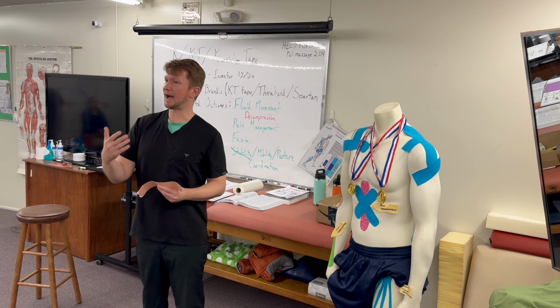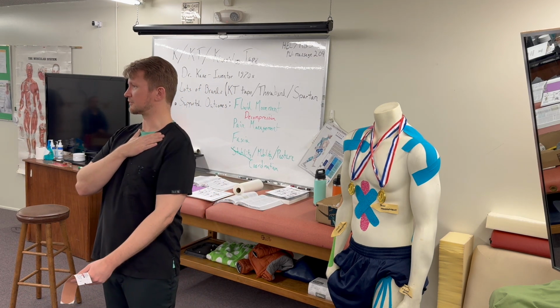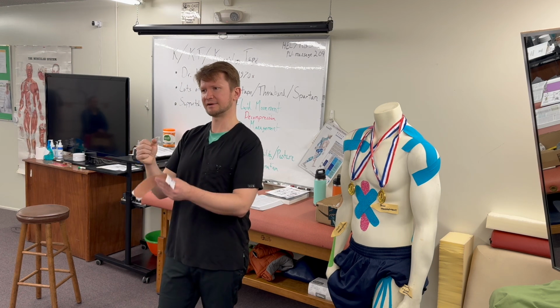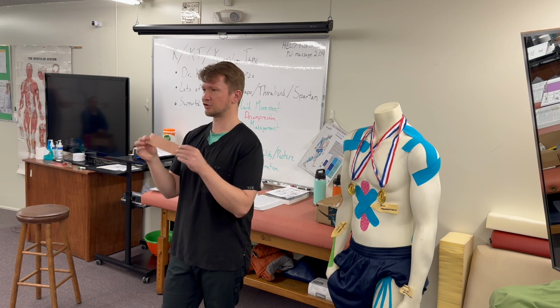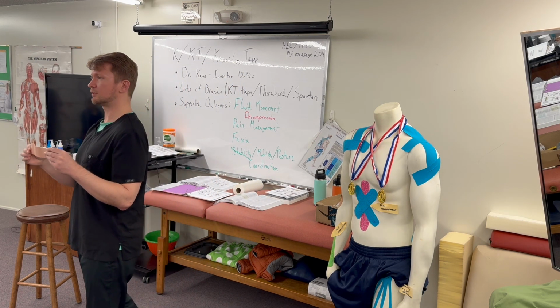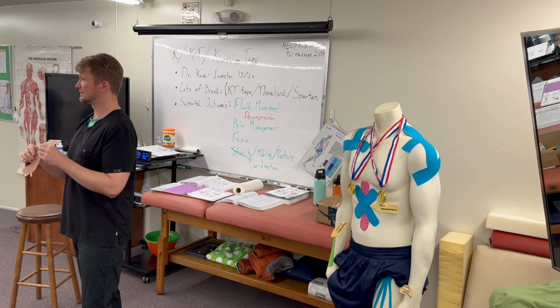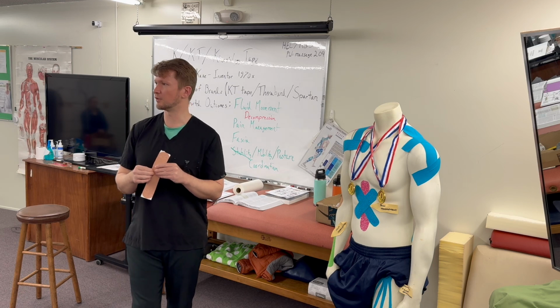So I like the feel of the sport stuff for me. My skin doesn't respond strangely to it. It holds better. It feels like it has a bit more tension and oomph to it, all of that. But this is your safer starting point. People trying it for the first time, start with a classic, not the sport version, and then go to the more aggressive ones.